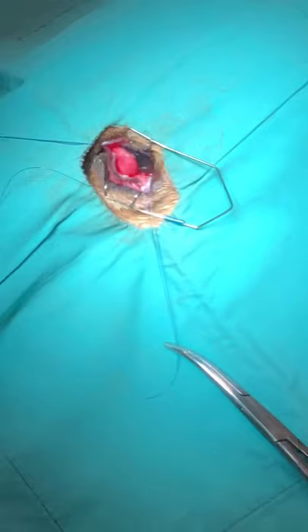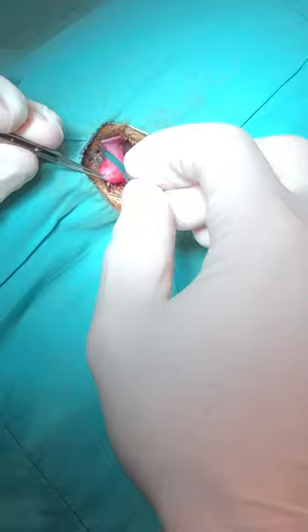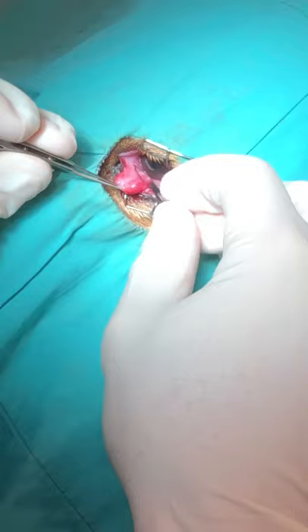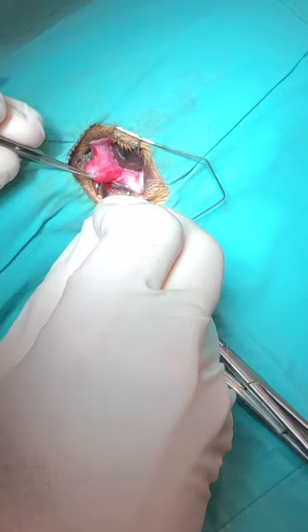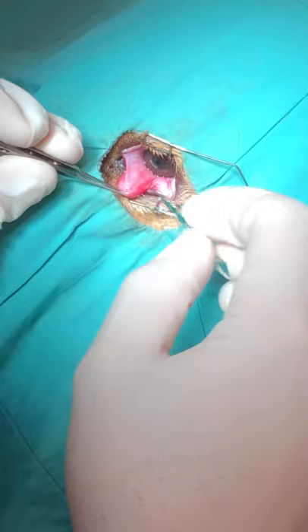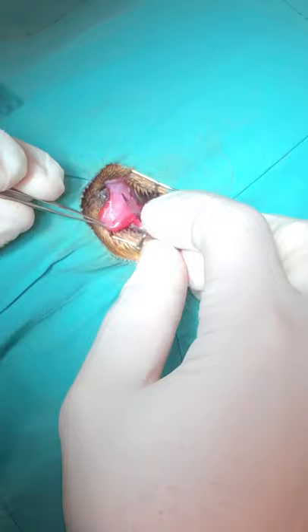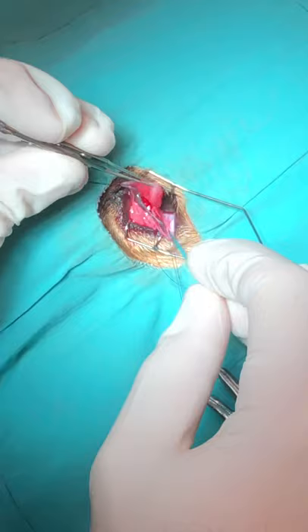After making the next incision on the bulbar side, you want to be ready to pass through to the other side and start sewing right away. As you make this incision, the edge of the conjunctiva that you want to sew to has a propensity to dive down toward the cornea and may get to a point where it's not easy to see — you could end up not sewing the proper things together and it'll certainly fail. Make the incision just where the back side of the gland would be, with pretty light pressure, just separating the superficial conjunctiva — notice that the vessel underneath remains intact.